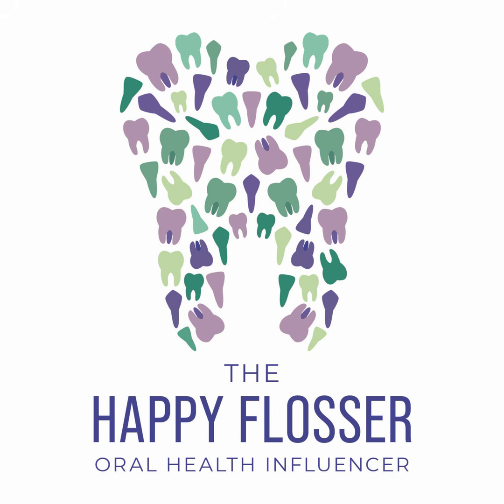So you're going to insert the tray into the patient's mouth and you're going to seat it from the back of the mouth to the front of the mouth to minimize the gagging and ensure that the material does full coverage around all of the anatomy. The key to the whole thing, as you seat the impression tray, you're doing things kind of all simultaneously. You also need to manage the lip. You have to pull the lip out so that it doesn't get stuck on the inside and impede your ability to get a proper view of those anterior teeth.